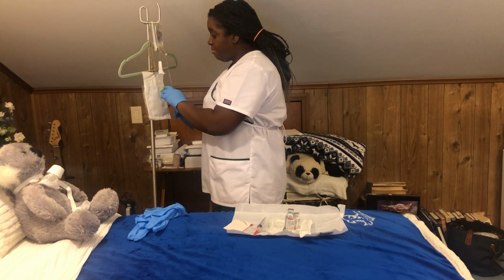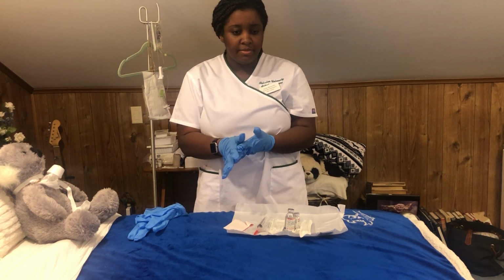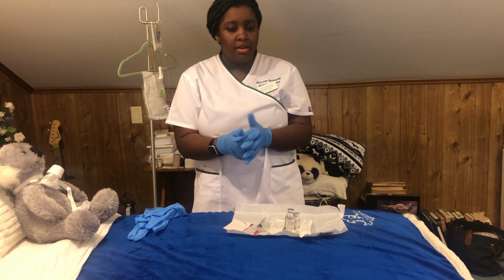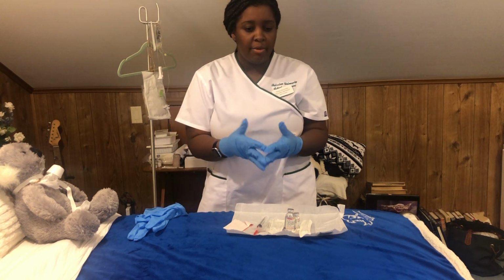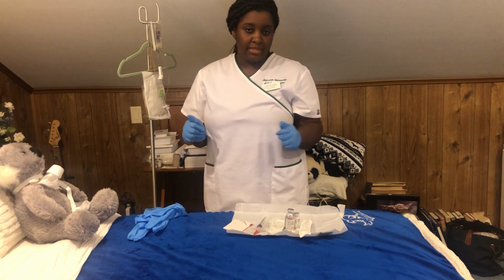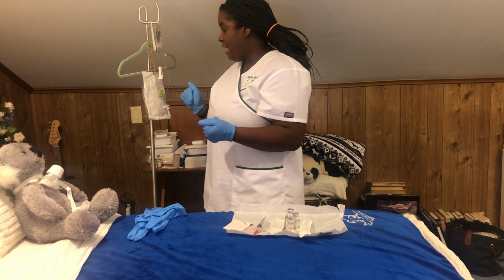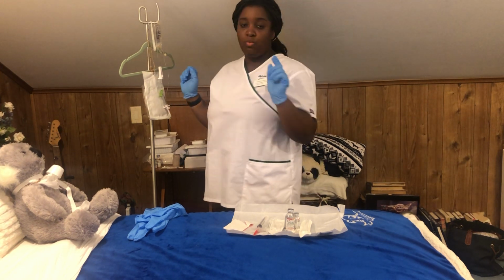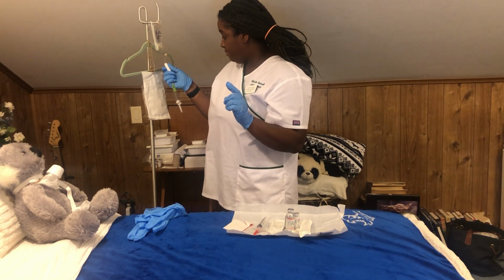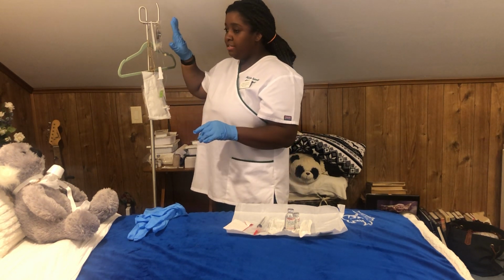So another step for this would be to let me see. Another step is for the Y port. So I'll just wipe off the Y port that's connected to the patient, making sure that aseptic techniques were done. But in this case, I'm just verbalizing that I will do that. And I will then set my drip rate to 100 mLs per hour, and I will then unclamp. Okay, so once I've done that, my infusion rate has been set, my drip is flowing. It's the law of gravity.